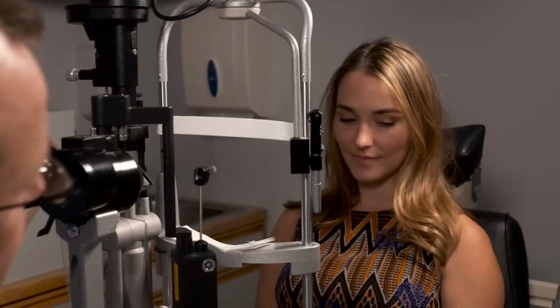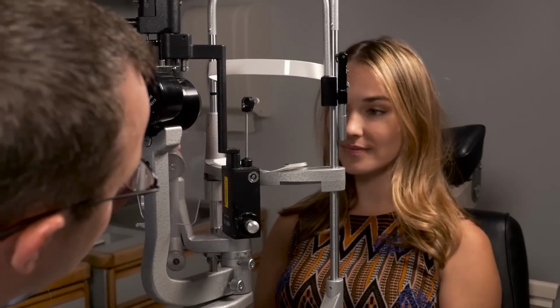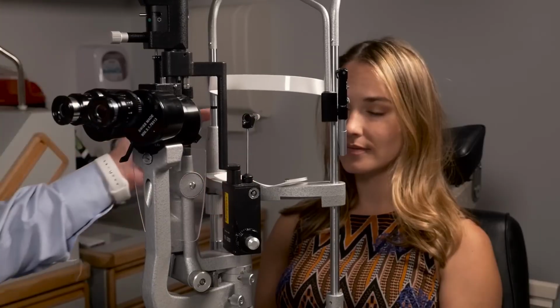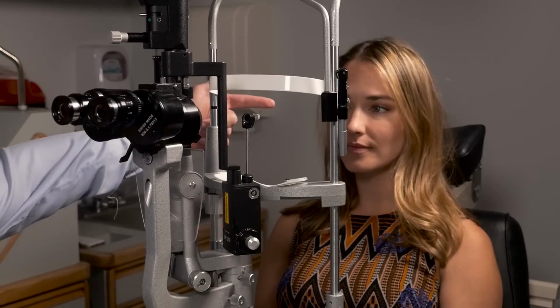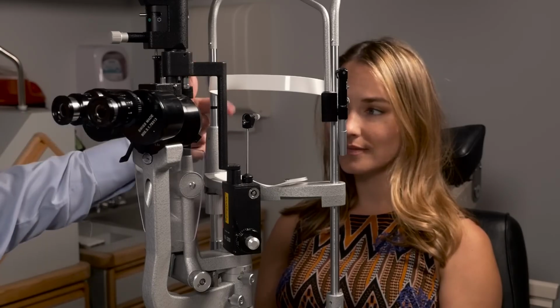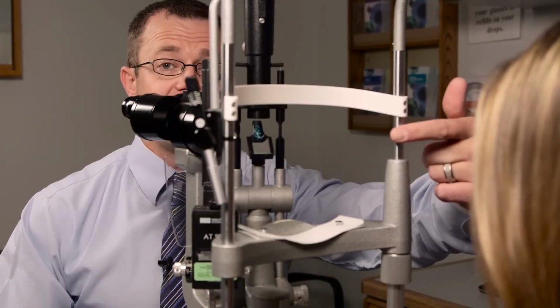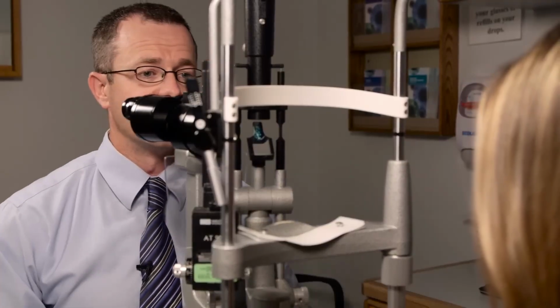So first thing you'll do is bring the slit lamp over towards the patient. You'll look where they are. The chin rest, I always eyeball where their chin is, and I'll bring it down to their level. However, you'll see a black mark here on the slit lamp. That needs to be level with the lateral canthus, or the lateral part of where the two eyelids come together. And so you're going to be lining that up so that their right eye is lined up with this black mark. That's one of the first key parts of getting a patient into the slit lamp.